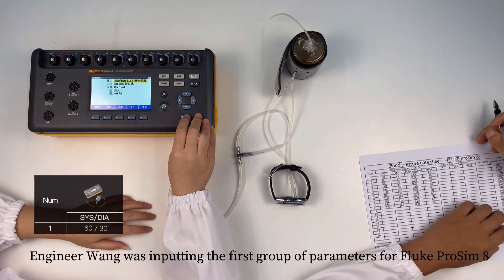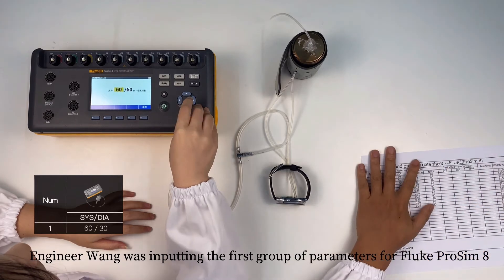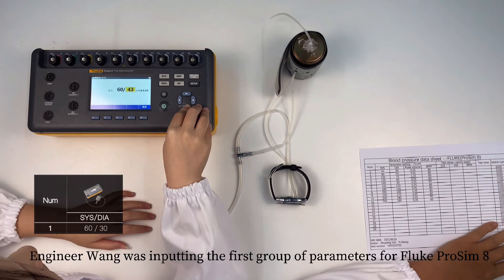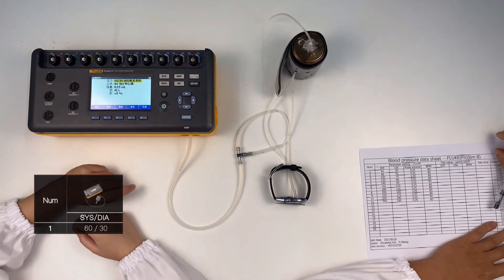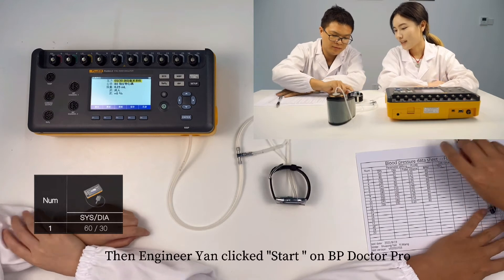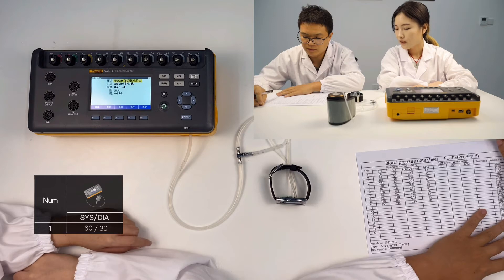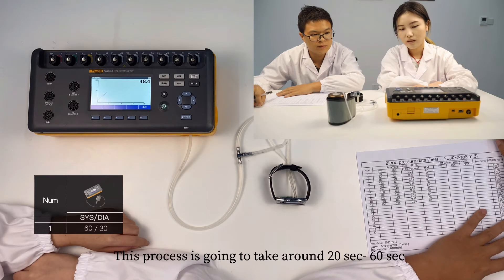Let's begin with the first group of data. Engineer Wang was inputting the first group of parameters for Fluke ProSim 8. Then Engineer Wang clicked start on BP Doctor Pro. We can see that Fluke ProSim 8 is simulating signals gradually. This process takes around 20 to 60 seconds.